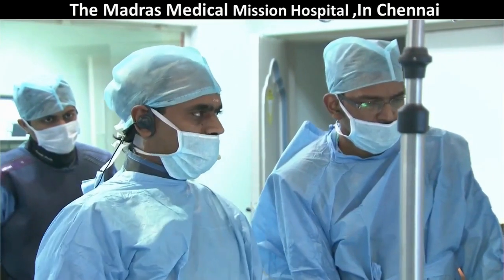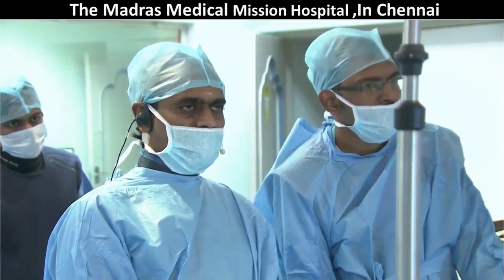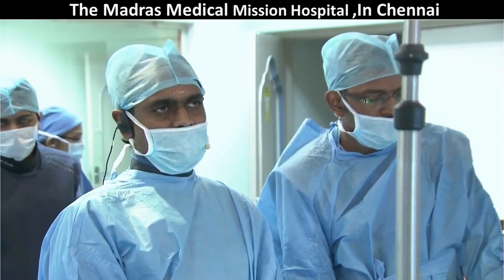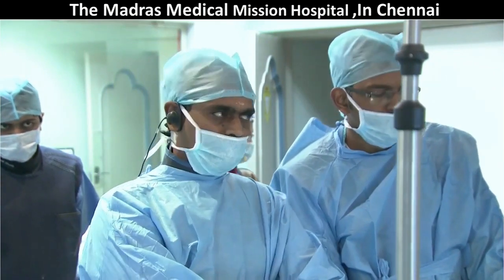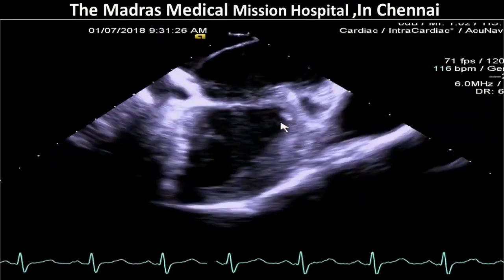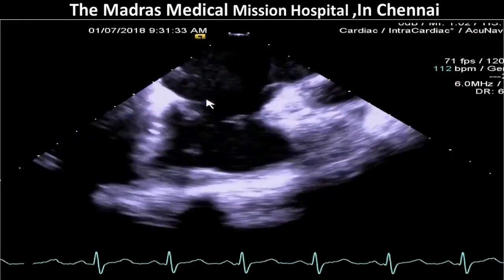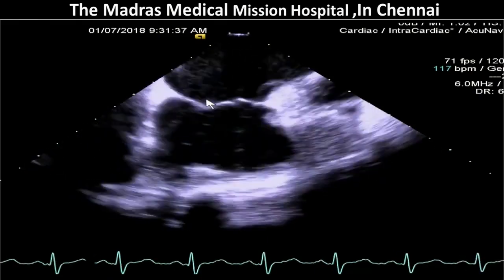So what we got in the morning was the superior and inferior vena cava saturations and pulmonary artery saturations. There was a 19% step up, which gives a 2.2:1 left-right shunt. The pulmonary artery pressures are normal. So right now I want to go live on the intracardiac echocardiography. Can you go live on echo? So now what we are seeing, I will show the parallel fluoroscopy also. Show side by side fluoroscopy and echo.